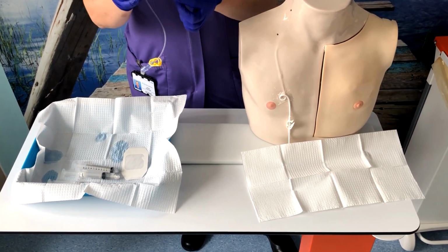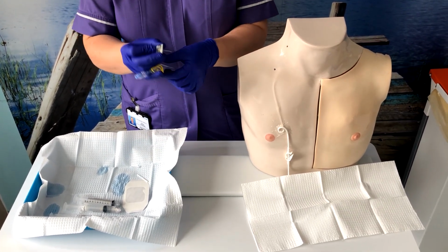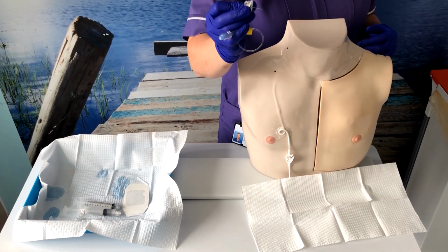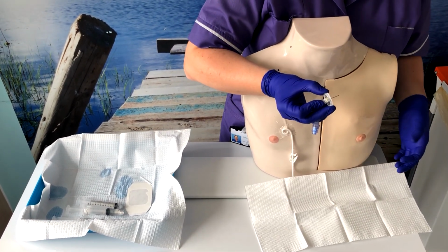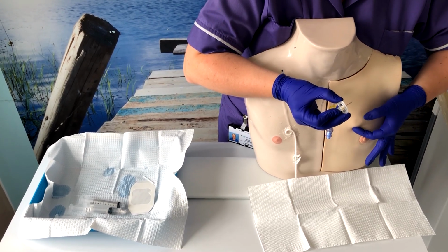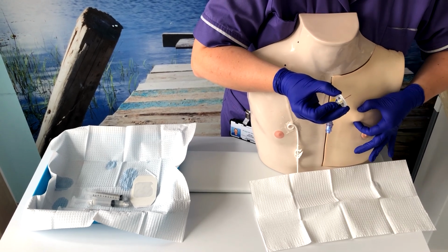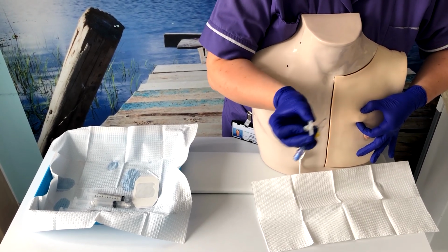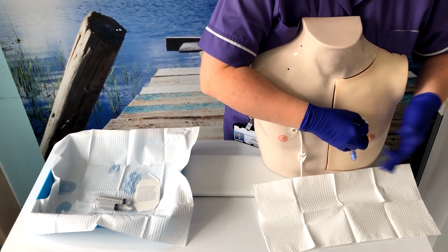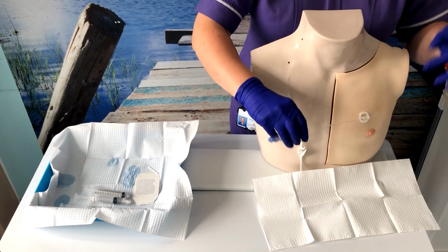So to access the port, we're going to take off the protective sheath, making sure you're holding on to the top of the needle as well as the side so you've got a good grip. And then you're going to locate your port with your other hand, so with a C shape, either top or bottom or side to side, just to locate and secure the port before you put the needle in, and then right in the centre, just push the needle straight in, and it should feel nice and firm and in place.